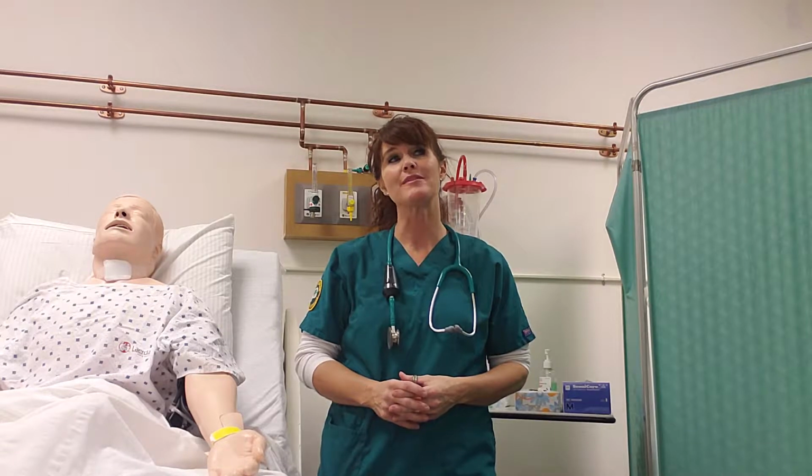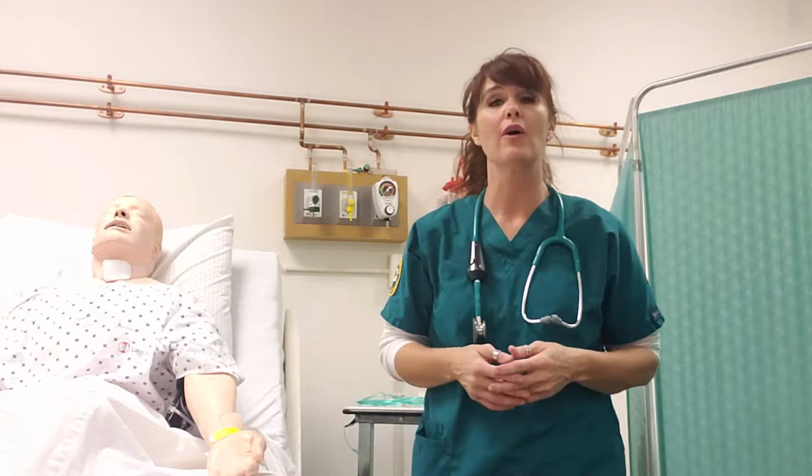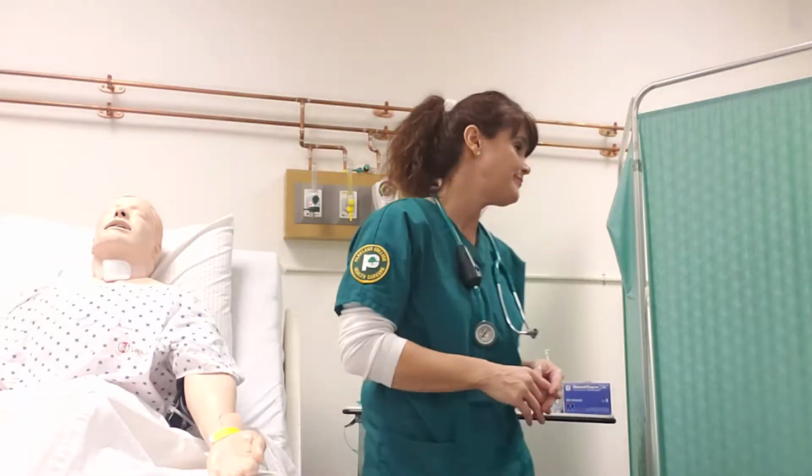Today I'm going to do a competency video on giving a patient a small volume nebulizer treatment. So the first thing you want to do is go over the patient's charts. You want to go over the doctor's orders. You always want to perform proper hand hygiene.